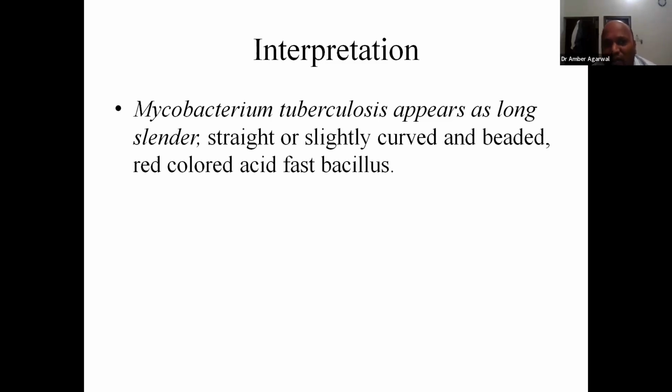Anyone can think? Could it be because of partially treated tuberculosis? Yes, look, in partially treated tuberculosis the load will go down. So let's say today you have done an MTB staining test. Today it will be 3+. After 1 month, if that patient has been treated well and responded well, it might come to 1+. And in that way, the stain will decrease.